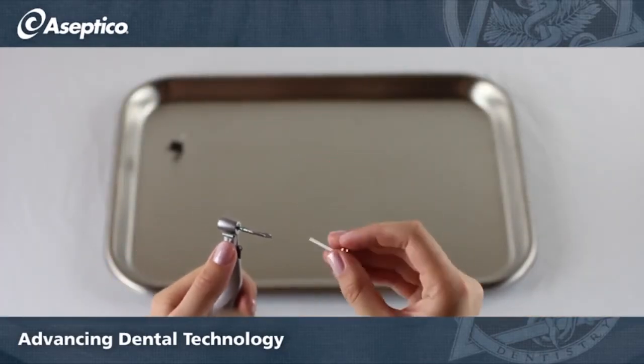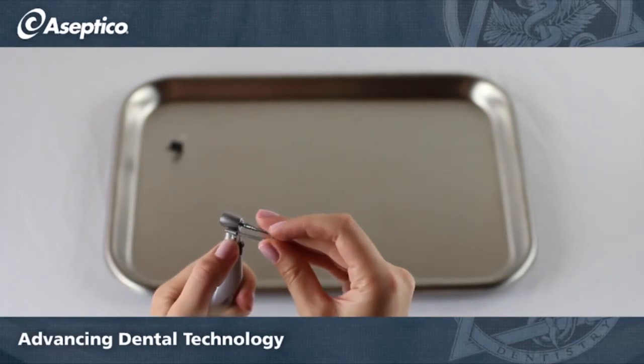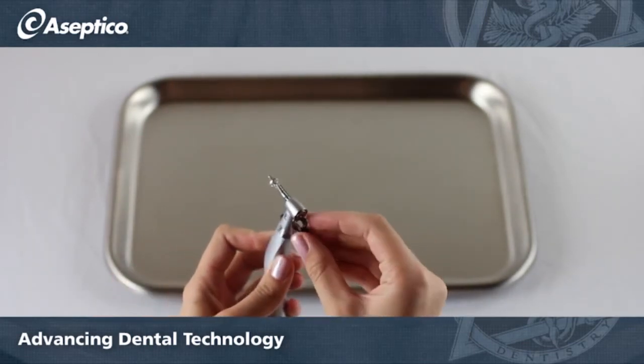The depth stop goes in just like it came out, by pulling down on the adapter lever. The irrigation clip will snap into place.